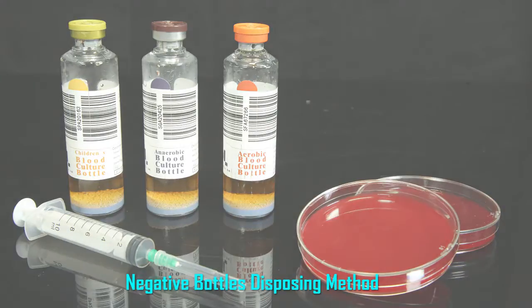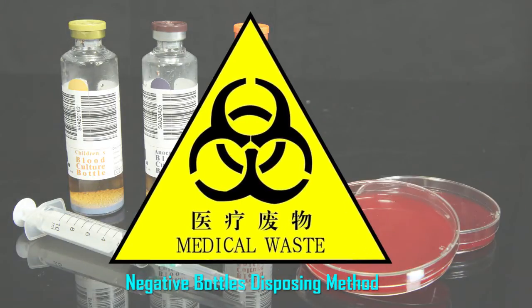Negative bottle disposal method: dispose of as dangerous medical rubbish.